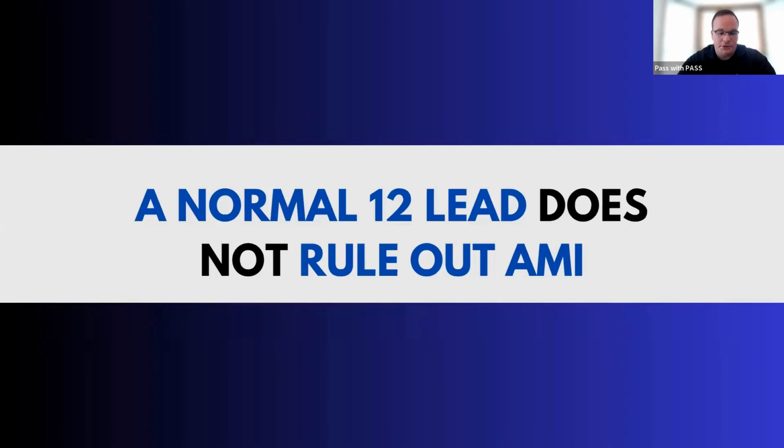So don't let the 12 lead itself gauge your treatment on what you're going to do for that patient. What I mean by that is, don't do a 12 lead and think, the patient doesn't need aspirin or nitro, the 12 lead looks fine. You still have to treat your patient at the end of the day. And that's with any piece of equipment we have in the back of the medic unit, whether it's pulse oximetry or a blood pressure cuff or 4 lead, whatever it may be, we still have to treat our patient at the end of the day.